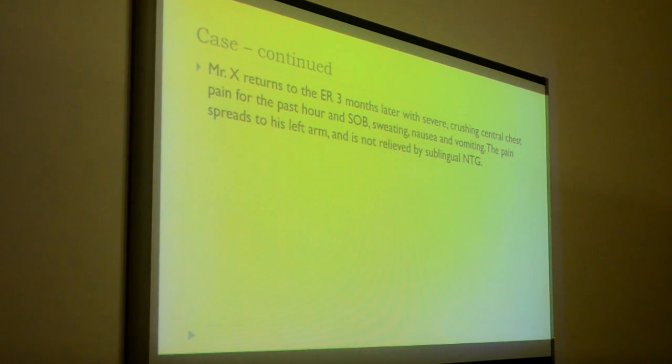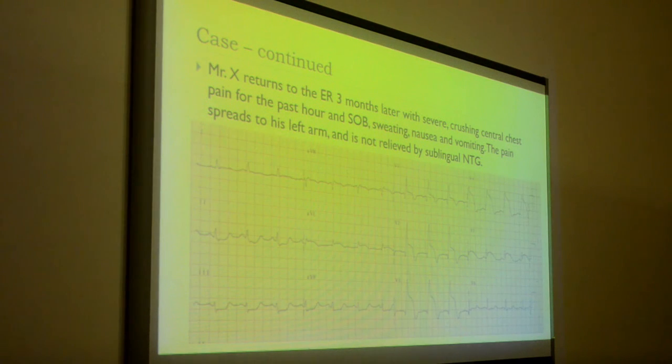No, myocardial infarction, yes. This is an acute MI, most likely. What do you see here? This is the most important ECG finding that you should know, the ST elevation. You see very clear ST elevation here. Now we're going to talk about the next thing, which is the ST segment.